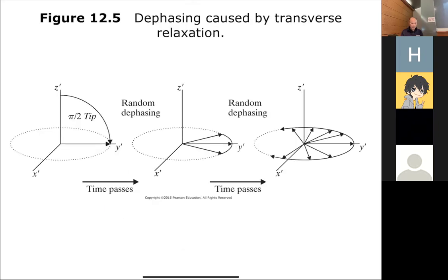And a lot of that is also determined by other things, which we'll get to. Right now we're talking about T1 and T2, which are intrinsic physical properties of tissue, but there's one other thing we won't talk about today called T2 star, which is the effective relaxation rate. That's affected by other things as well. Essentially, we're going to go high level and then get deeper and deeper. Okay.